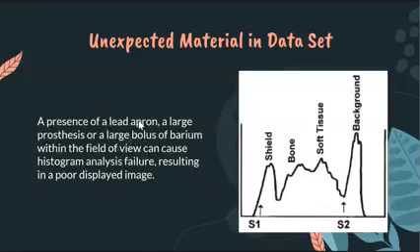Okay? So si lead apron, di ba kay absorb man yan? Absorb niya ang X-ray. Absorb niya ang X-ray because it's a metal. And also a large bolus of barium, which is the contrast media. Okay? These materials absorb X radiation, which will portray a very light, very bright, color white na image within these areas of the materials. Okay?